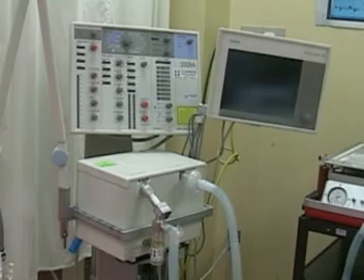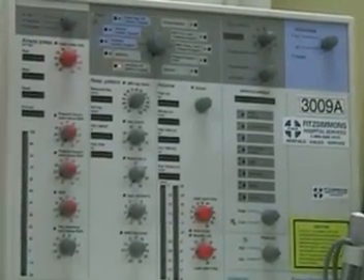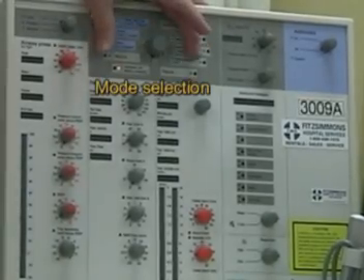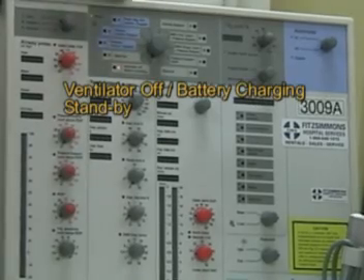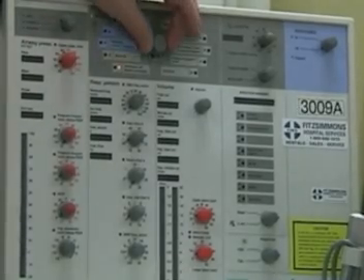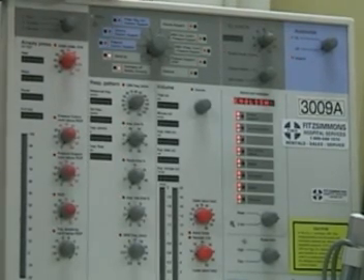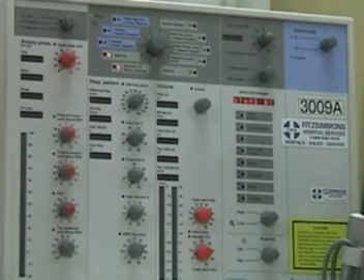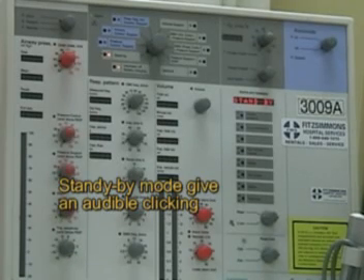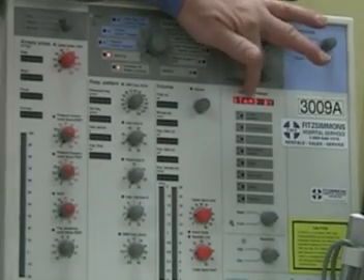We're looking at the Siemens Servo 300 ventilator, taking a close-up view of the panel. In the modes section, you can see ventilator off, battery charging, and standby. Standby activates the electronics, keeps everything warm and active, runs the initial check, and you can hear a little clicking which indicates it's in standby mode.